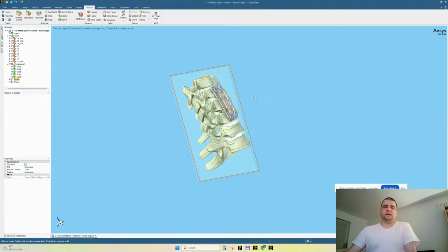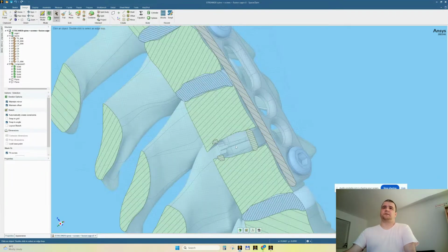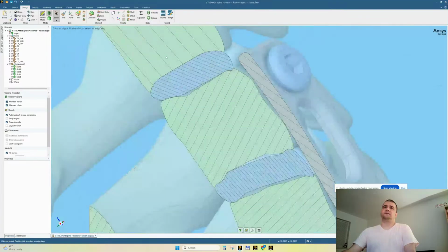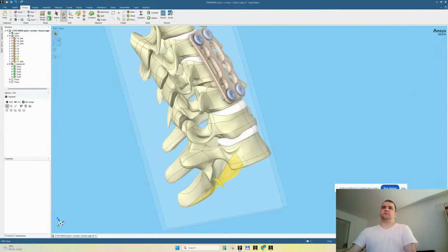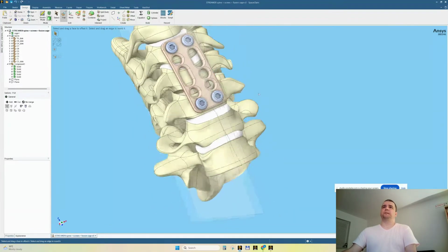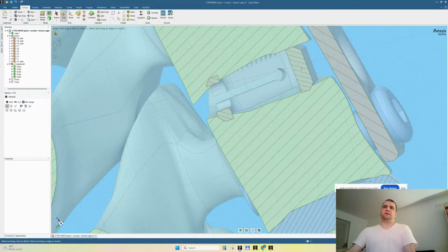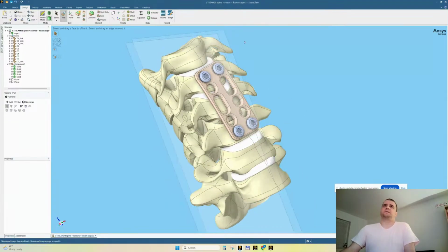I talk about the relation between discs and vertebrae. Design section. And with this cage, at this moment, this looks very nice. Very nice. And the other section view. So if you paid attention, it is cut. So it's a good Boolean operation. The software understood the geometrical logic, but the software does not understand what I am simulating here about titanium alloy and bone. And of course, it doesn't understand.